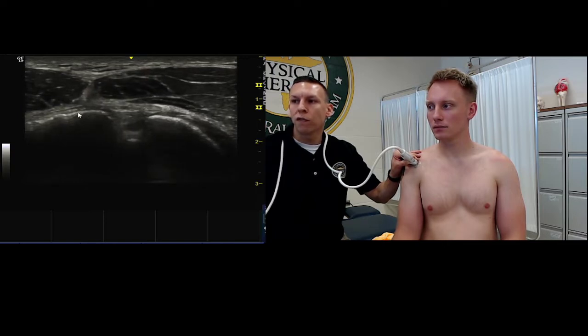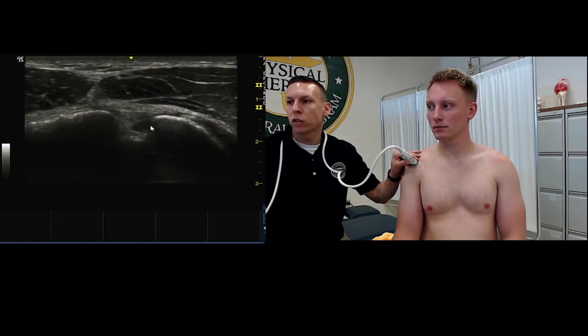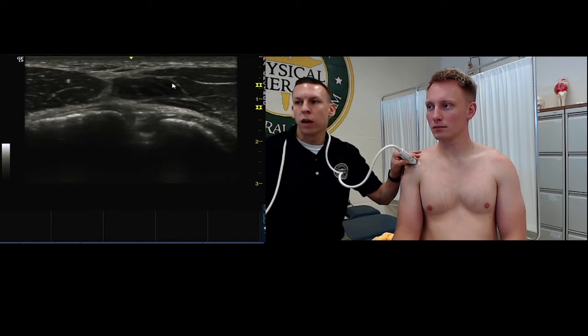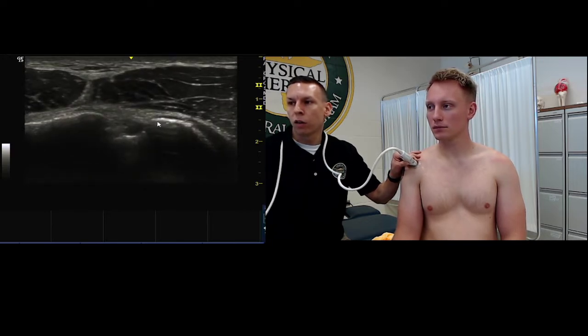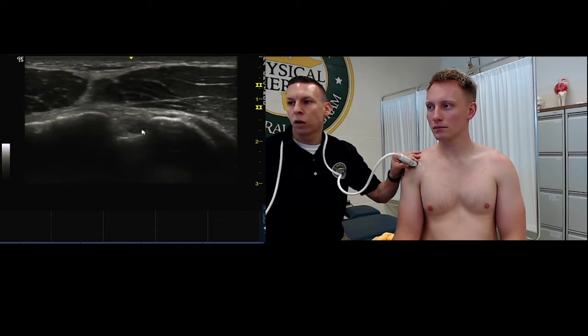Once you find the greater tuberosity and the lesser tuberosity, we can start to identify a lot of different structures. Namely, on the top, you're going to see the deltoid, which is a very large muscle all throughout the shoulder region. This can almost get in our way. So in someone with very large shoulders, it might make the rotator cuff a little more difficult to visualize. But when we come deep, we're going to look for these bony acoustic landmarks as our backdrop, and we're going to start identifying structures.